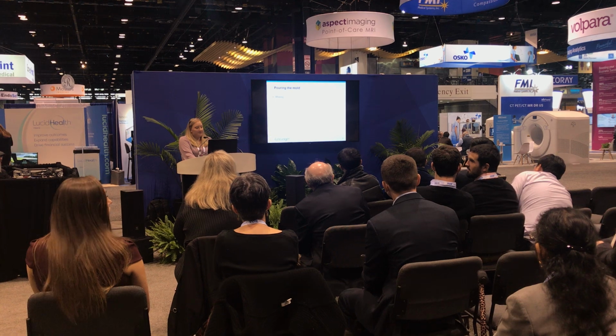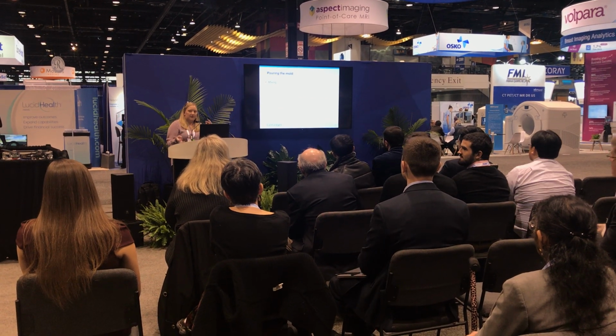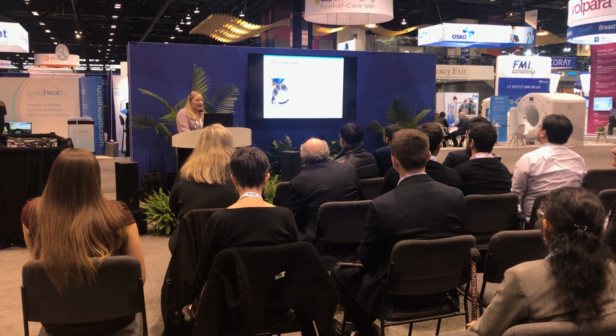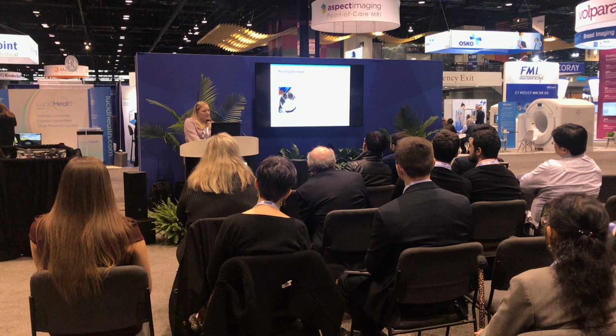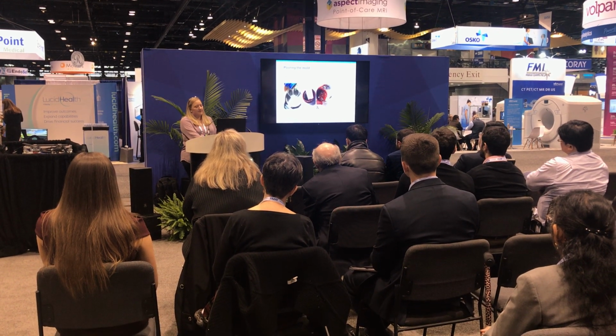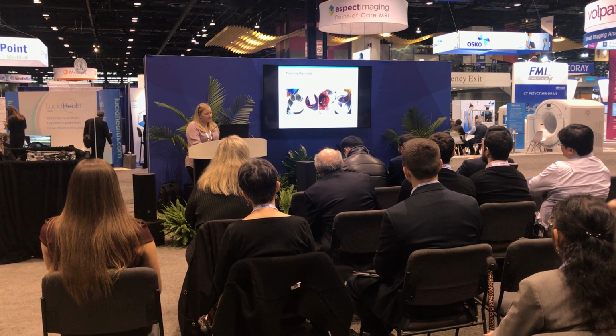So, mixing. With Smooth-On, it's really nice because it's equal parts, but just follow the recommendations of whatever silicone you're gonna use. I tend to use a digital scale still. You pour one part in, then you put your pigment in, mix the pigment around, pour the other part in, and then you should be good to go.